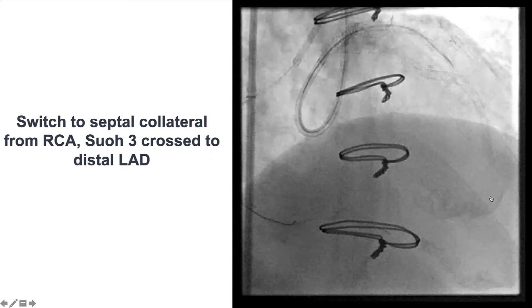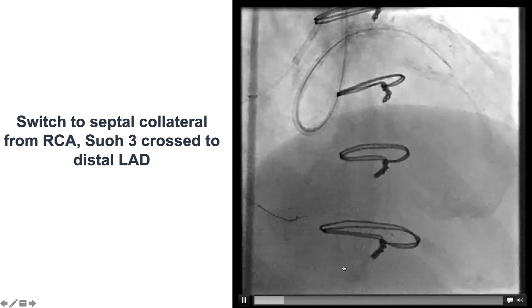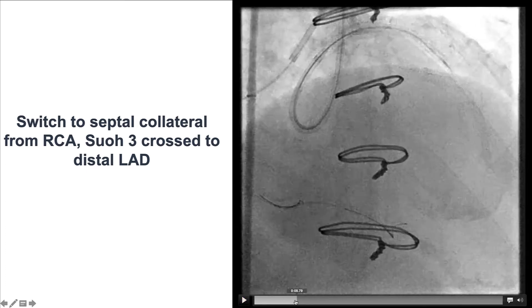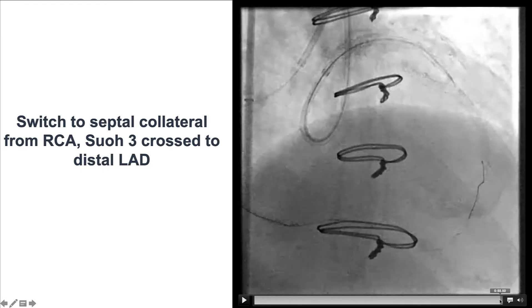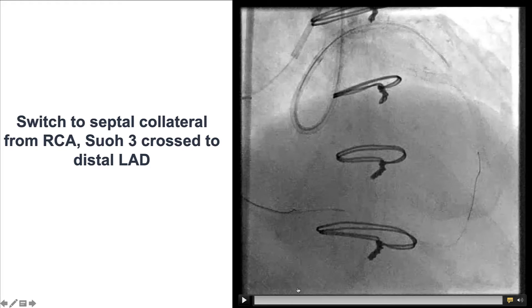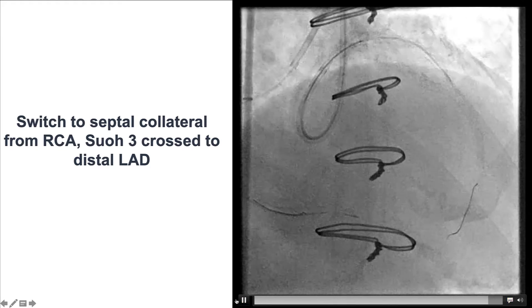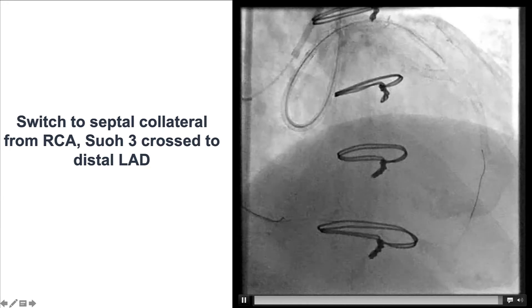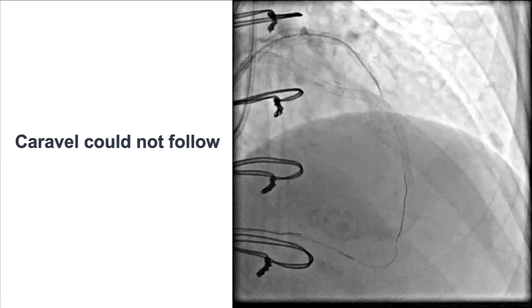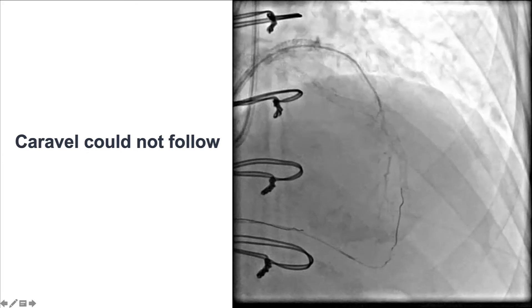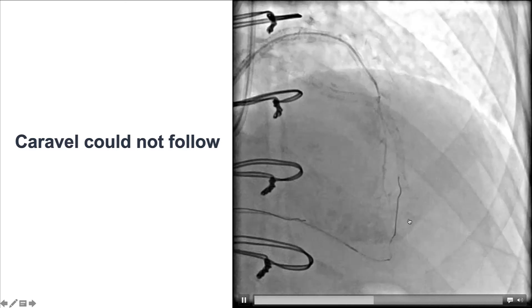We then went to the right coronary artery and used a SUO-03 guide wire, which was able to cross all the way into the LAD, partially within the previously occluded in-stent segment. The SUO-03 has become the guide wire of choice for crossing both septal and epicardial collaterals. Unfortunately, the Caravelle microcatheter could not follow the SUO-03 guide wire.